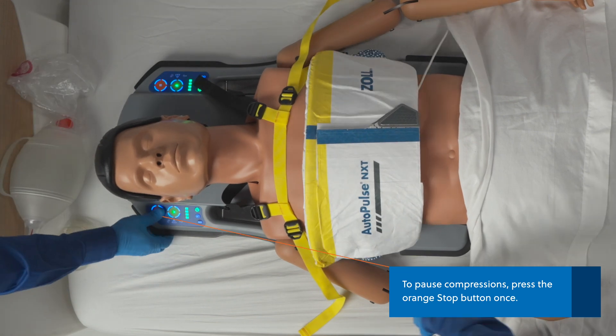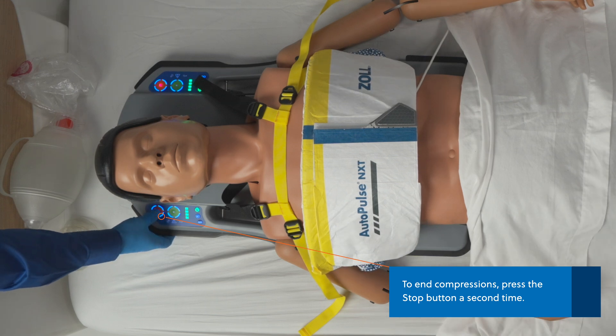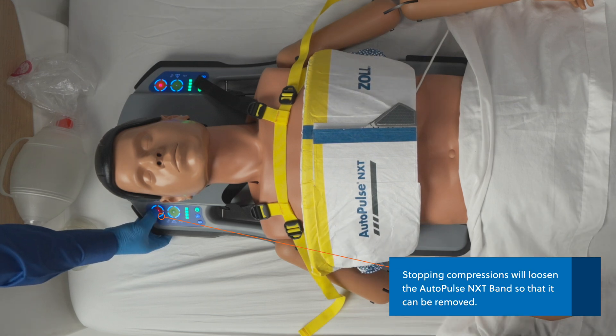To pause compressions, press the orange stop button once. To end compressions, press the stop button a second time. This will loosen the bands, allowing for patient removal from the platform.